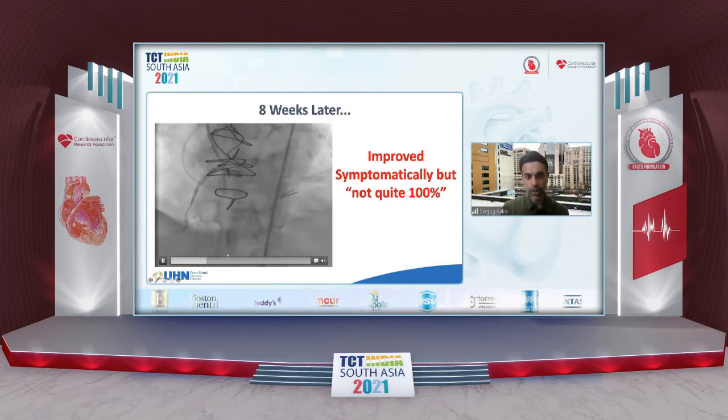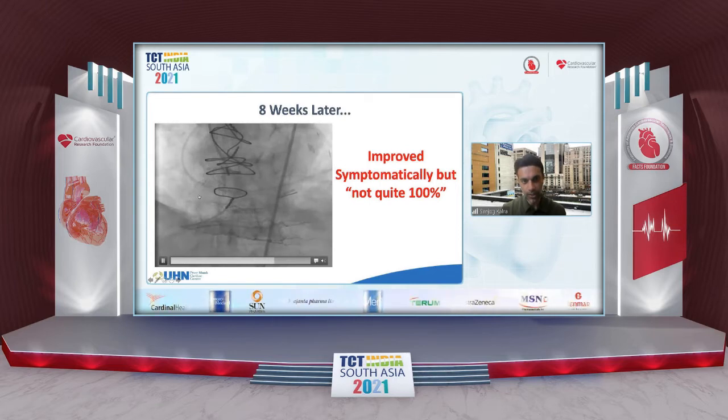There's a nice myocardial blush distally. The challenge is there's a big dissection flap right in the middle of this large bifurcating branch distally, and that dissection flap goes all the way up the vessel.